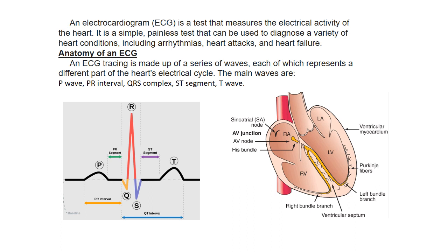An electrocardiogram, ECG, is a test that measures the electrical activity of the heart. It is a simple, painless test that can be used to diagnose a variety of heart conditions, including arrhythmias, heart attacks, and heart failure. Anatomy of an ECG.